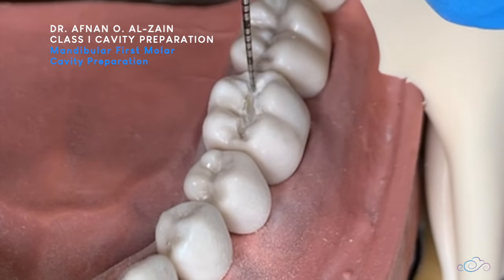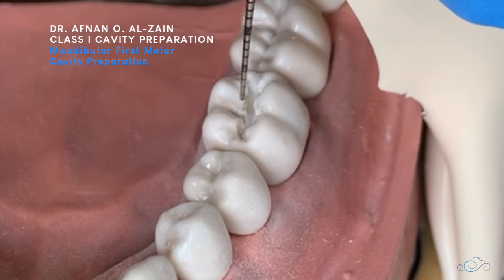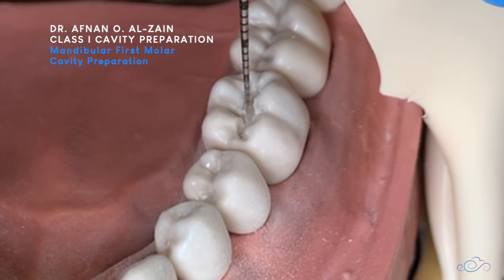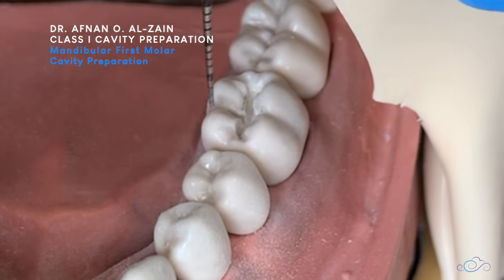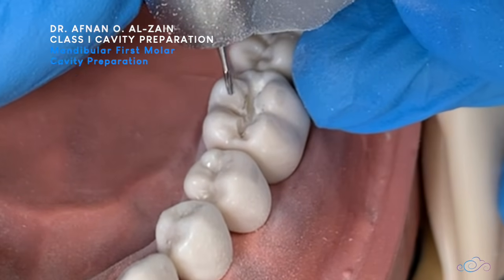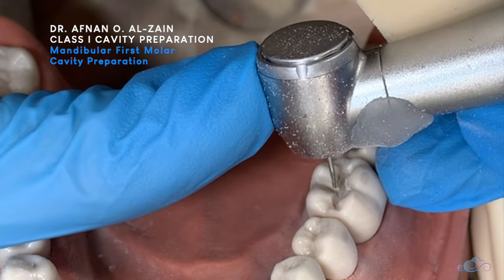So we check — the cavity depth is the same throughout. And if we look closely, we need to round the line angles. We don't round the whole cusp. Sometimes what you can do is support the handpiece on the side of the preparation to help guide it.